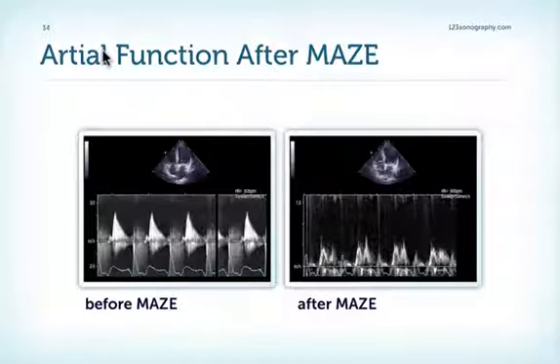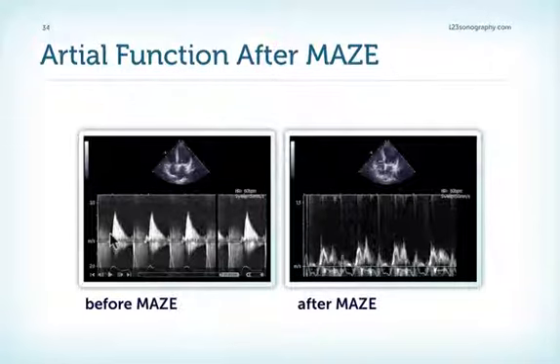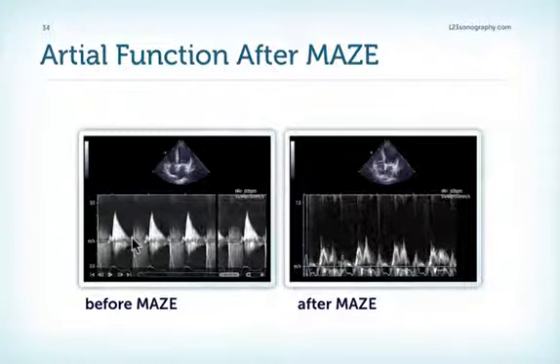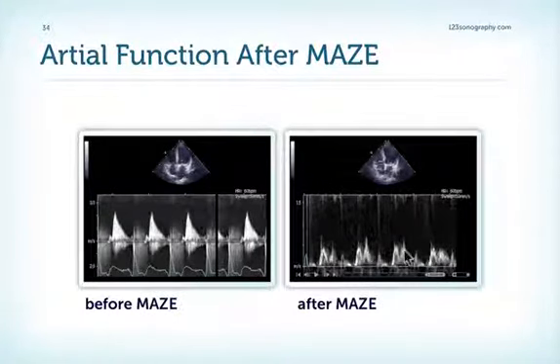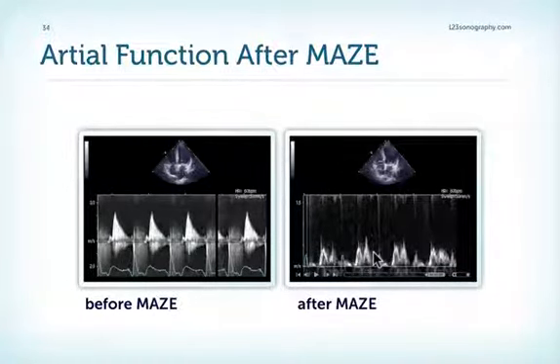Here is an example of a patient who underwent a MAZE procedure — a technique where atrial fibrillation was treated. Before the procedure, the patient had atrial fibrillation and there was no A wave. After the procedure, an A wave is noted, indicating adequate atrial filling, and the patient improved significantly.